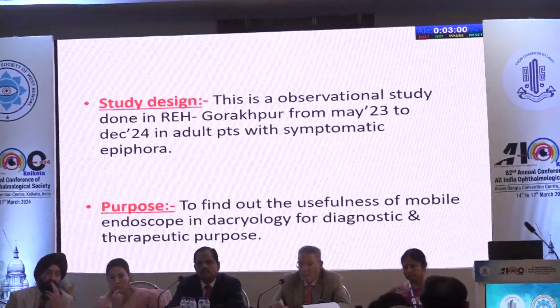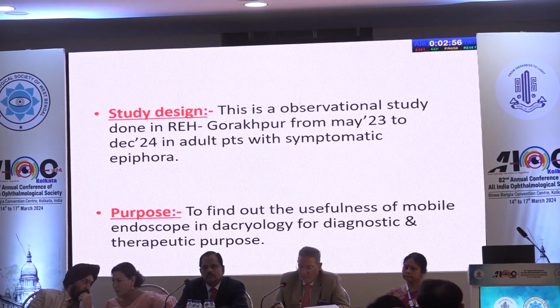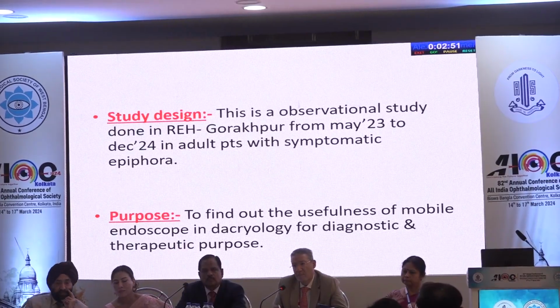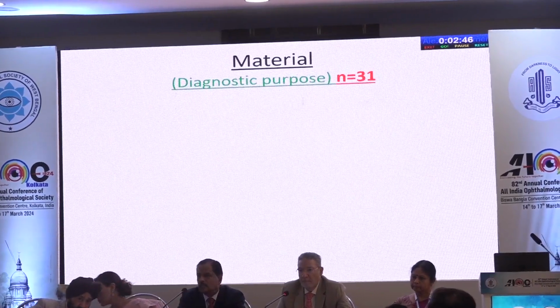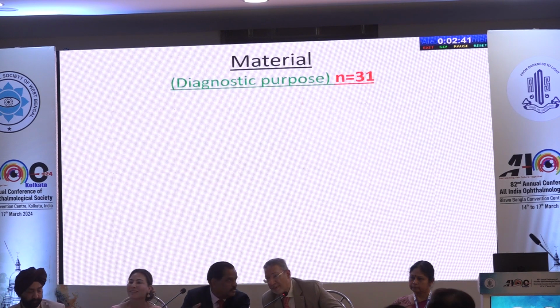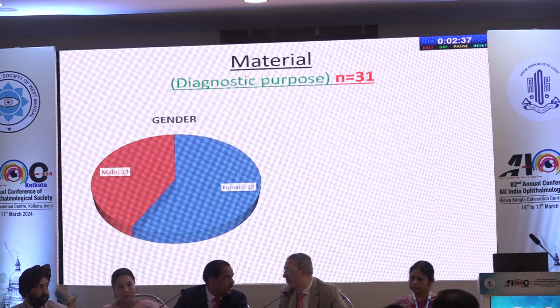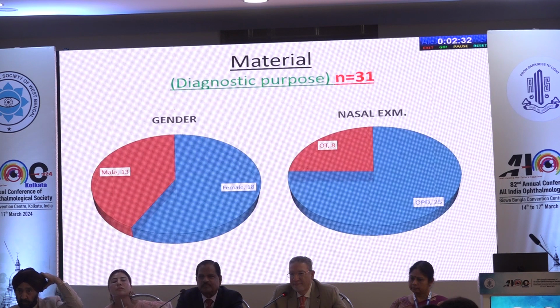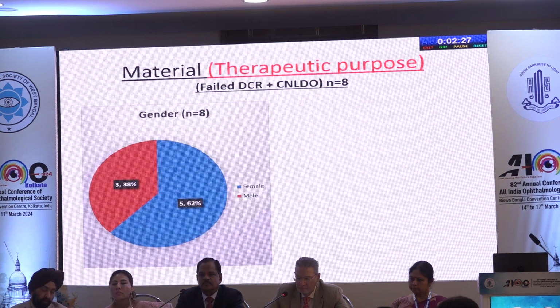So we tried to find out the usefulness of this endoscope in dacryology for diagnostic and therapeutic purposes. We have done an observational study in our institute with patients of symptomatic epiphora, divided into two parts, diagnostic and therapeutic. For diagnostic purposes, we selected 31 patients. Among the 31, 18 were female and 13 were male. Of these, 25 were examined in the OPD and 8 in the OT. Average age was 52 years.